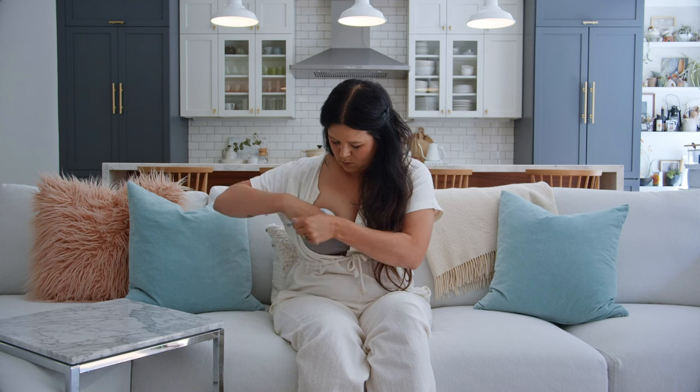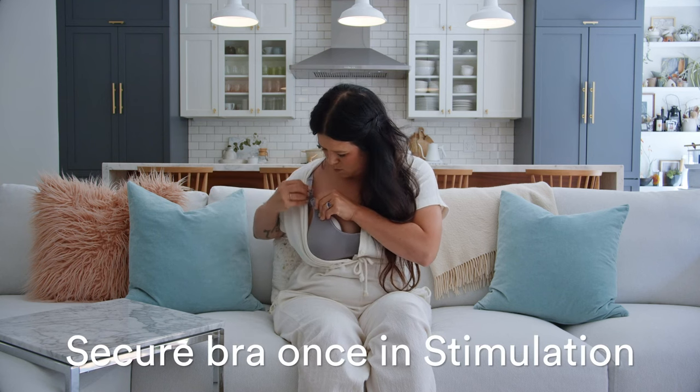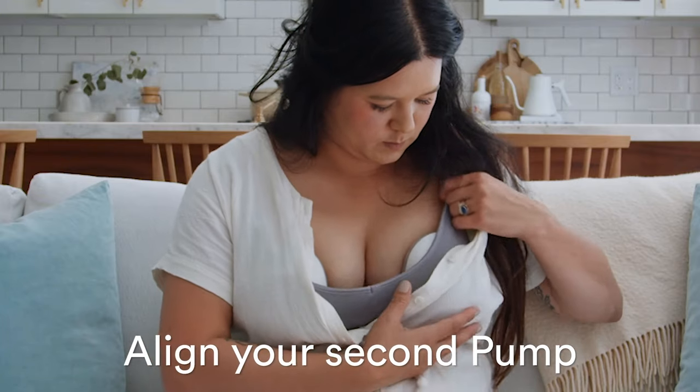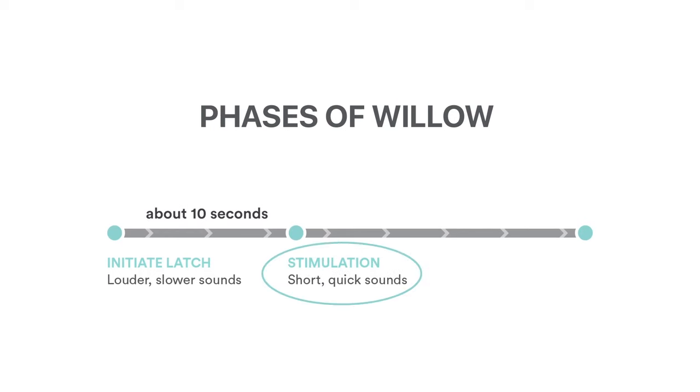Once the pump is in stimulation, close your bra and hold Willow so it doesn't shift. If you are double pumping, repeat the same steps for your other breast. You'll be in stimulation for up to two minutes.